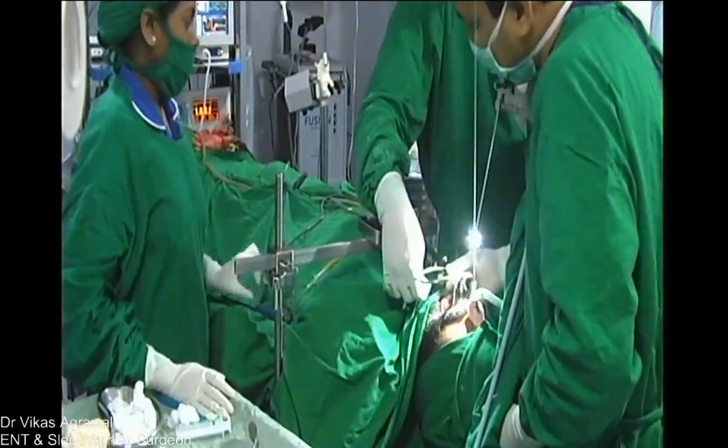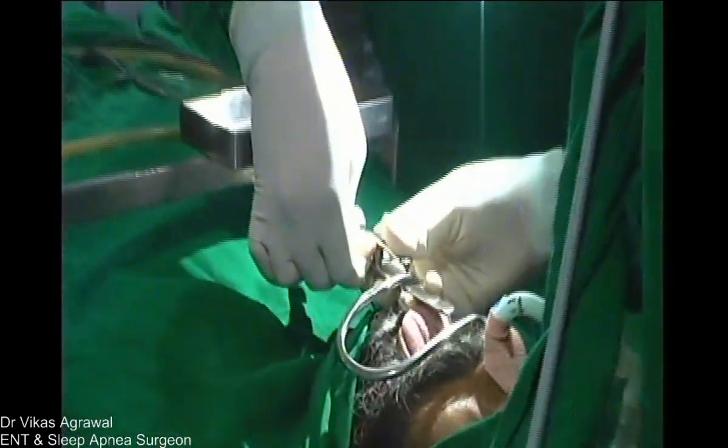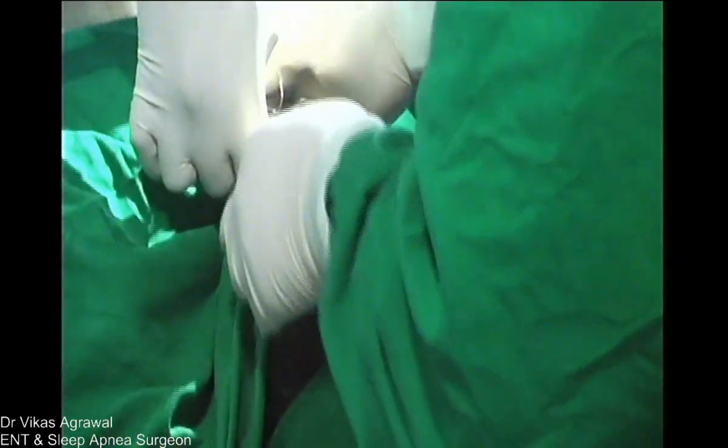So what I am doing is pull the tongue out. Pull the tongue out. So we have to remain in midline. We are pulling the tongue out and applying the mouth gag.